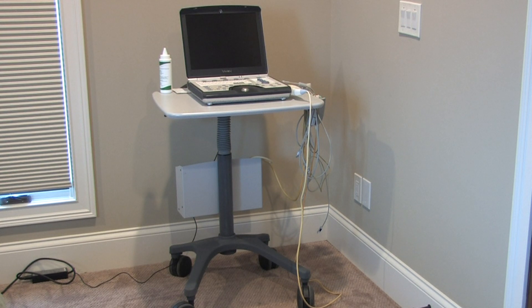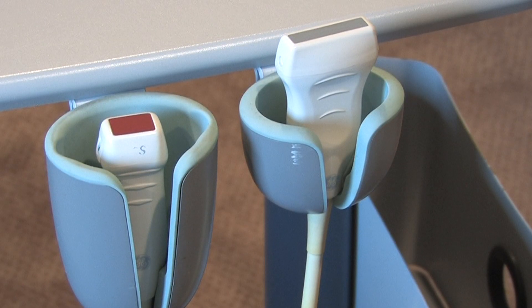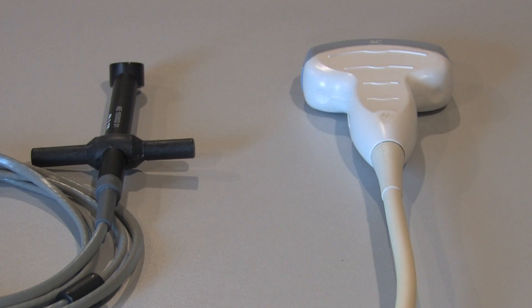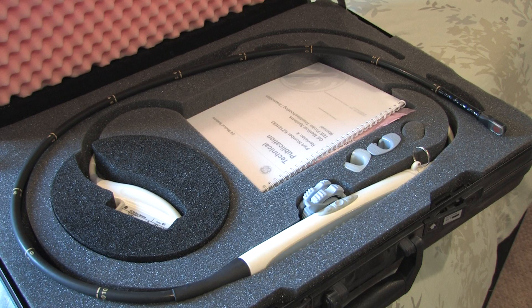Hi, thanks for having a look at this auction. This is the Vivid Eye and the cart that are being sold. Here are the probes — two of them: the cardiac and vascular probe, the non-imaging PEDOF probe, and the abdominal probe. This is the TEE probe and the case that it comes in.